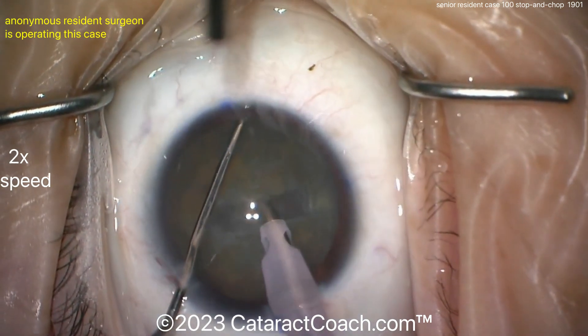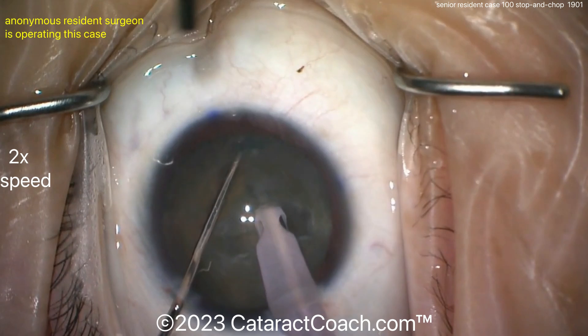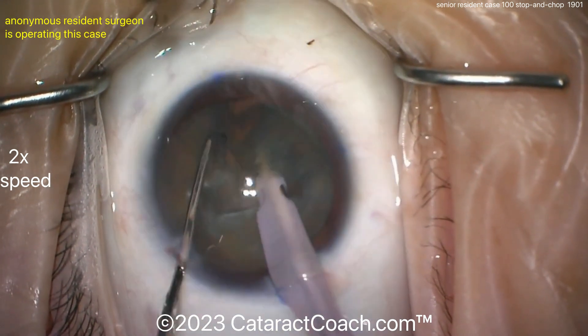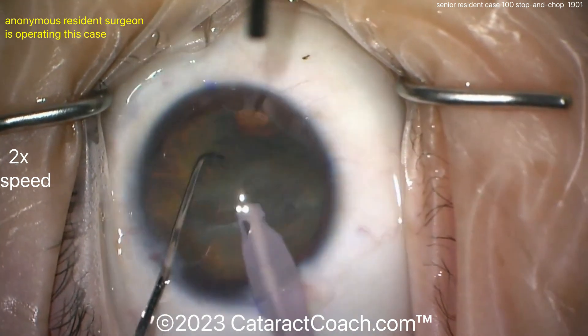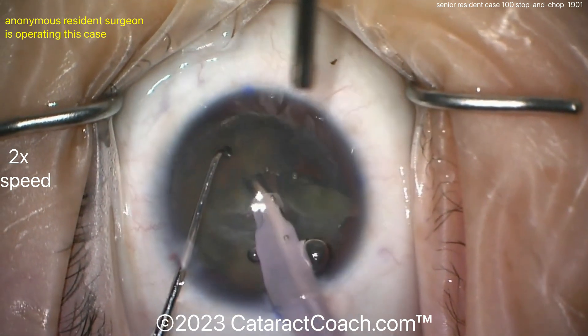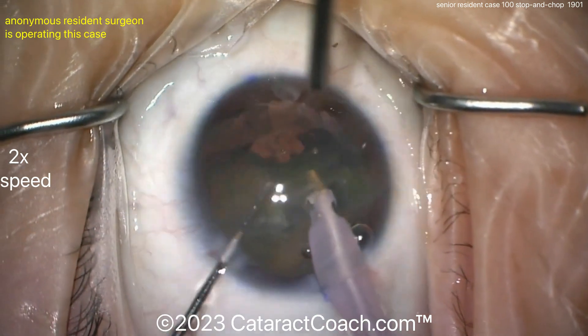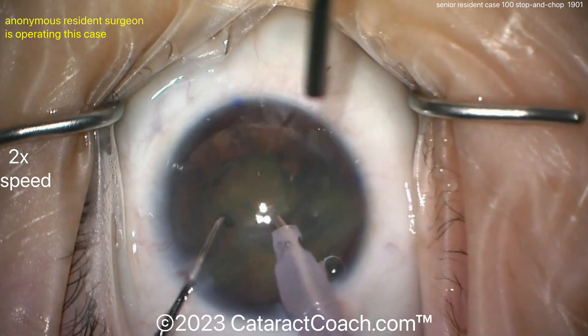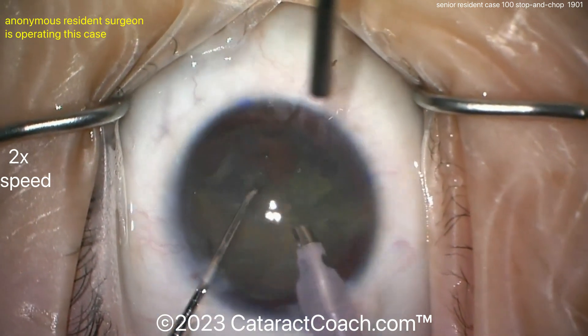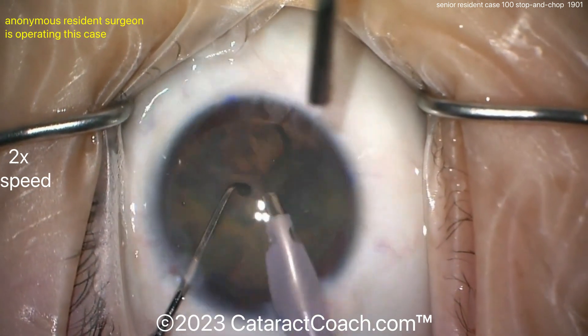Now let's see the stop-and-chop: there was the stop part, now let's see the chop. Pre-placing the chopper around the equator — here's a horizontal chop. Beautiful, nicely done. If you're going to do this horizontal chop for the first time, this ball-tip type chopper can be very helpful — many manufacturers make it. Again, beautifully done. Good technique. I like how the eye stays in primary position.